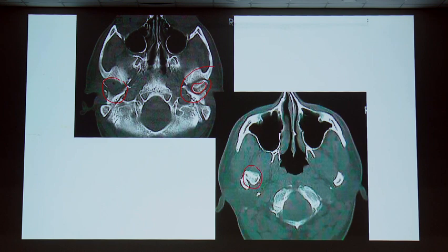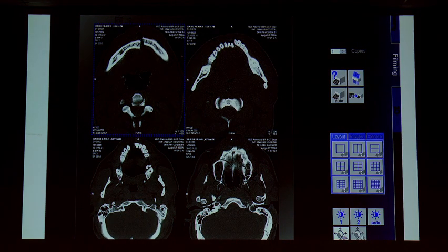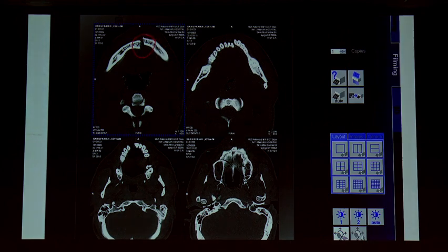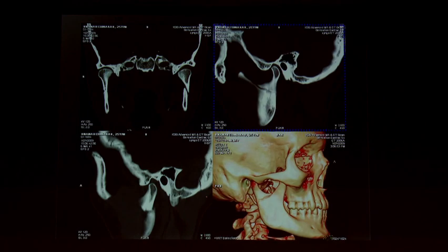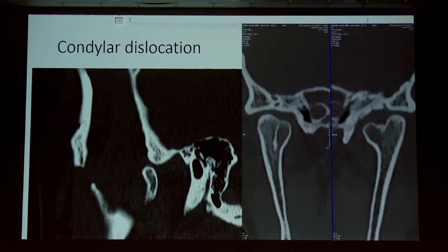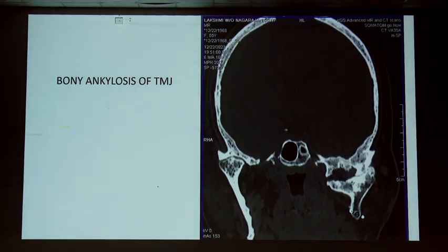Since the mandible is a ring, fracture of the condylar neck and condylar process fractures occur together. 3D reconstruction beautifully demonstrates the fractures. Sometimes the condyle may dislocate anteriorly and the patient cannot close the mouth — it remains in an open position because the condyle is not reducing back. Anesthesia is required to reduce it. If not treated properly, it will go for severe shortening and bony ankylosis.